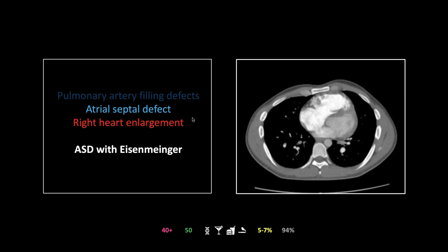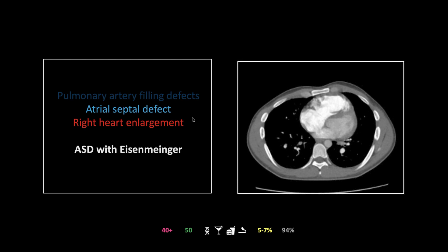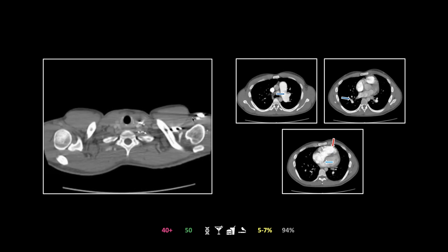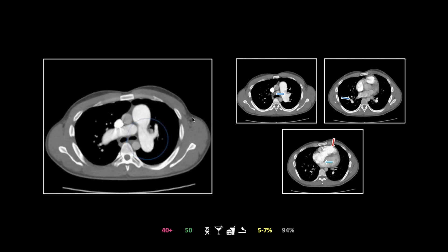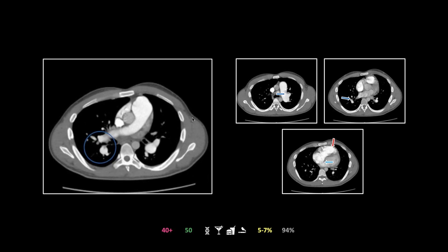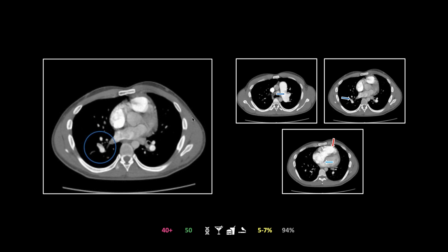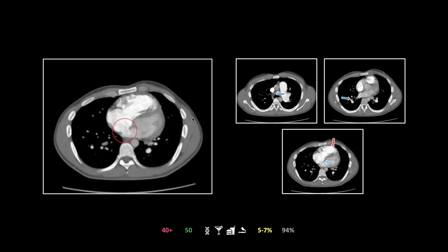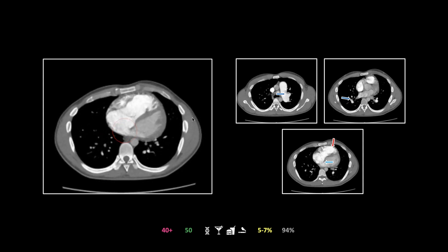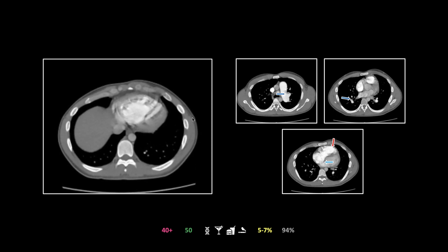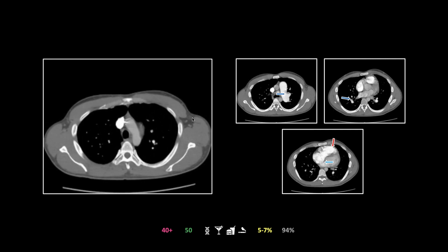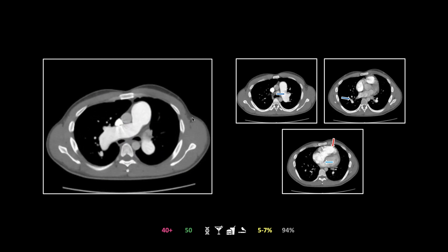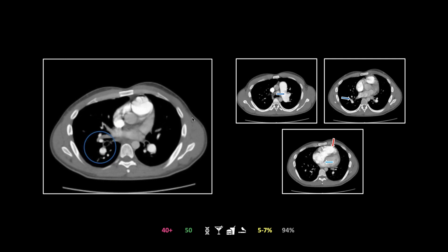This patient is at risk for paradoxical embolism — with right-to-left shunting, another PE could shoot into the left-sided circulation. Note the size of the pulmonary arteries; they are quite large, obviously due to the high volume of chronic left-to-right shunting recirculation. There is right-to-left shunting across the ASD and a large, hypertrophic right ventricle as well.